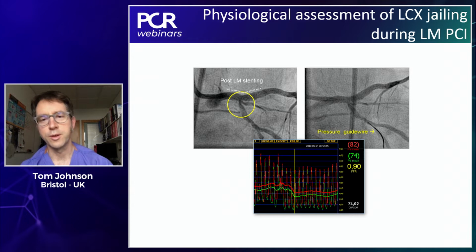I wonder, this was recently played out in a case example shown by Greg Stone on Twitter that resulted in the most incredible discussions, exactly these discussions around, do we really use physiology at this point, or should we just be optimizing by the angiogram? What do we do? And there was a clear split amongst the community. So, Goran, what would be your practice in this situation?